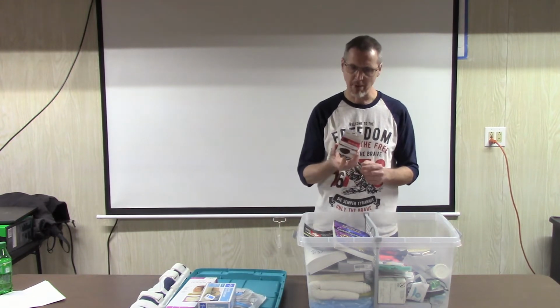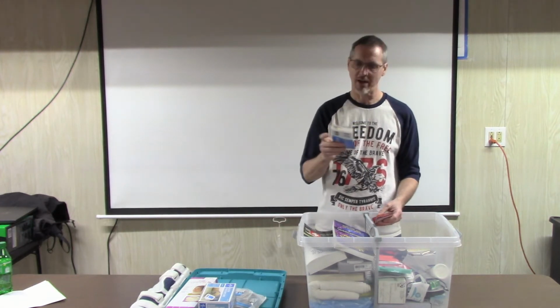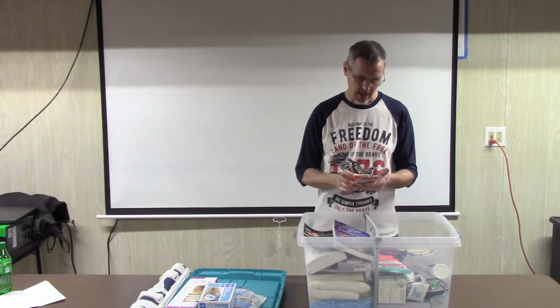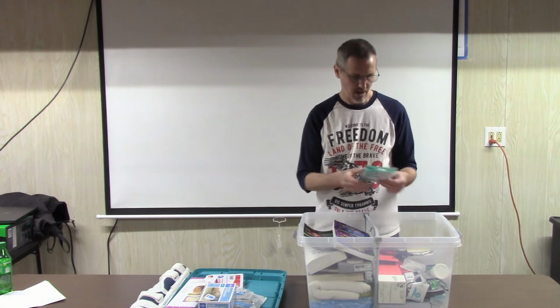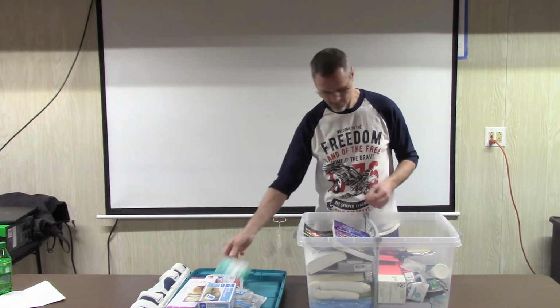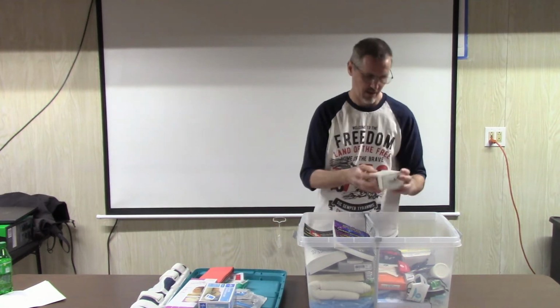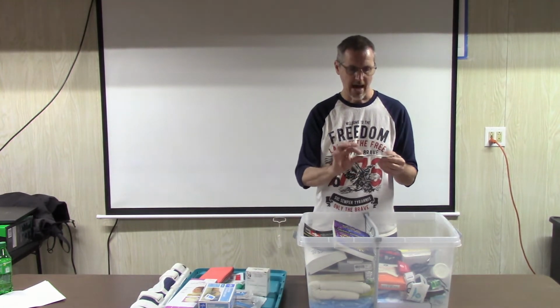Here's an actual eye patch with elastic on it. Some moleskin, not huge medical, but great for blisters. Something you should have in your kit. Some of the liquid bandage. Some burn dressing. This is a dental emergency kit. You can do like, I think it's a temporary filling. So we've got a couple of these. The splint stuff. It's a 3-inch compressed bandage. Iodine swab stick.